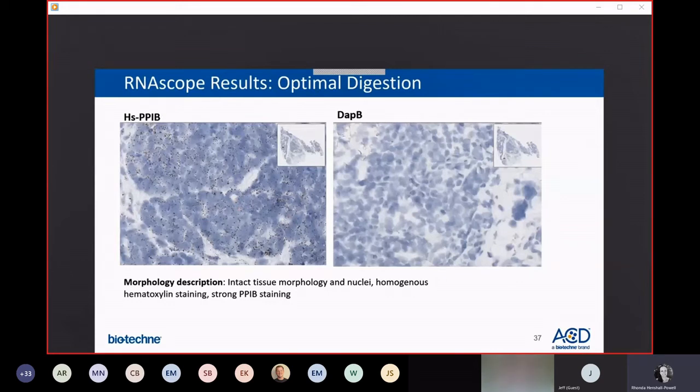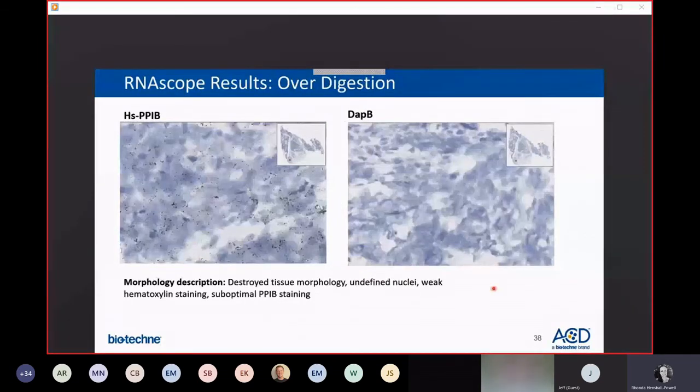This is the kind of digestion we like to see in a tissue sample, where the tissue morphology is a little bit softened almost, but you're getting a good amount of positive control probe staining and you don't see any signal here. However, if you go too far and you over-digest, the tissue starts to look kind of smushy and falling apart. You actually start to lose RNAscope signal as well. Because the tissue architecture is kind of falling apart at this point, the signal is sort of clustering up and you have less signal than you had in optimally digested tissue. The nuclei are now undefined.